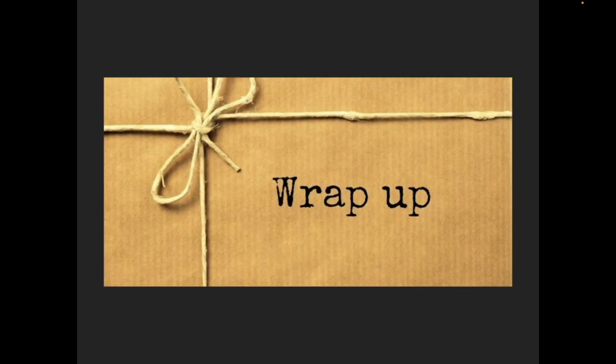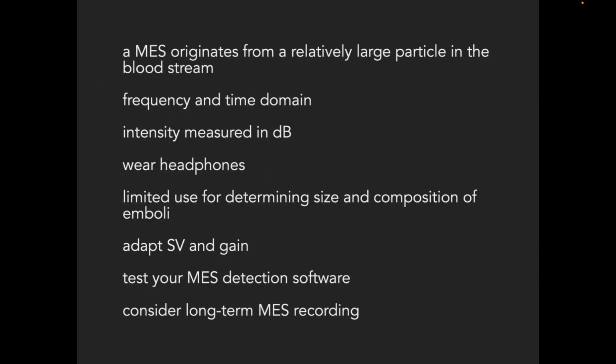So let's now wrap up what the take-home messages of this tutorial are. If a relatively large particle passes through the sample volume of the TCD in the middle cerebral artery, it will give rise to a microembolic signal.